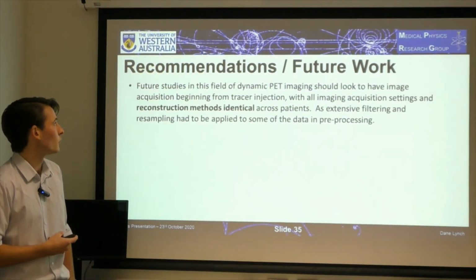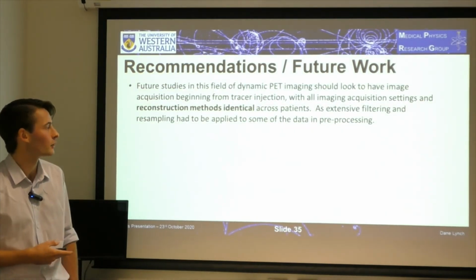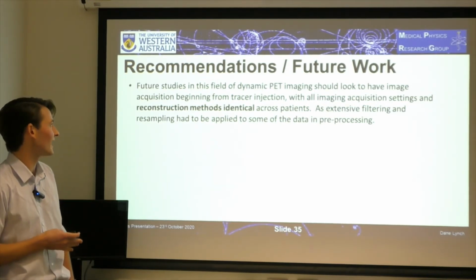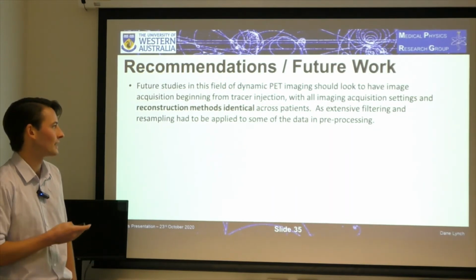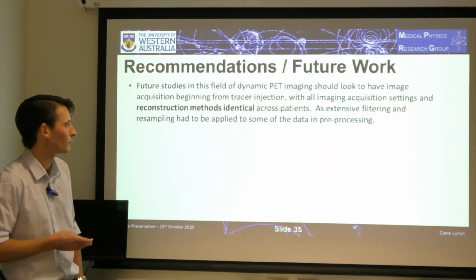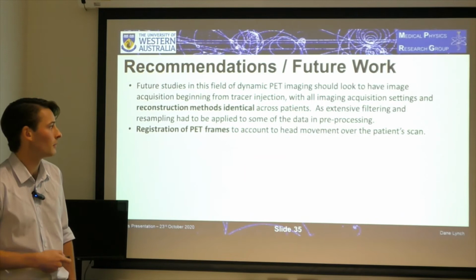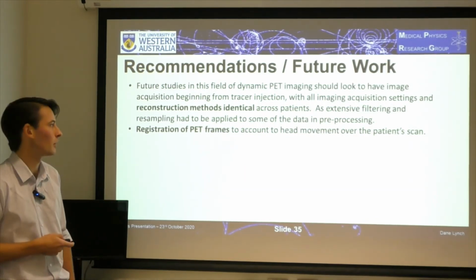So, some ideas for recommendations and future work. Future studies in this field of dynamic PET imaging should look to have imaging acquisition beginning from tracer injection, with all imaging acquisition settings and reconstruction methods identical across patients, as extensive filtering and resampling had to be applied to this data in the pre-processing stages. Registration of PET frames could be explored to account for the head movement between dynamic PET frames.